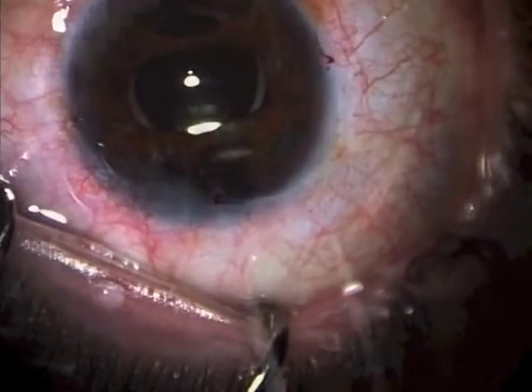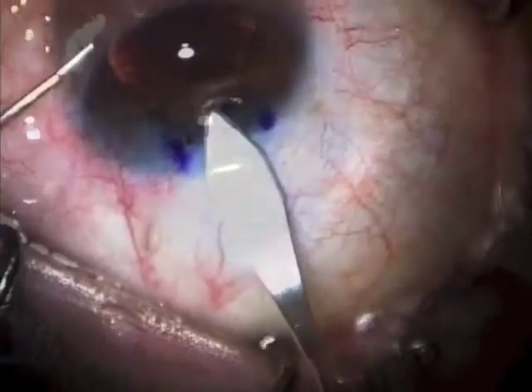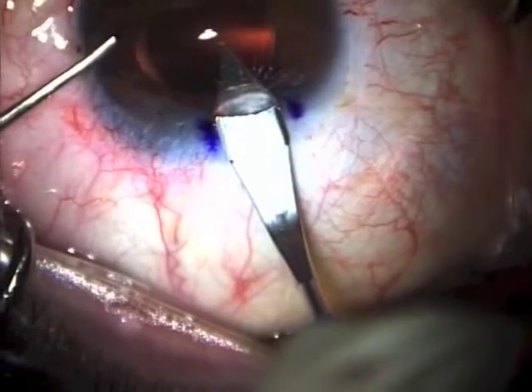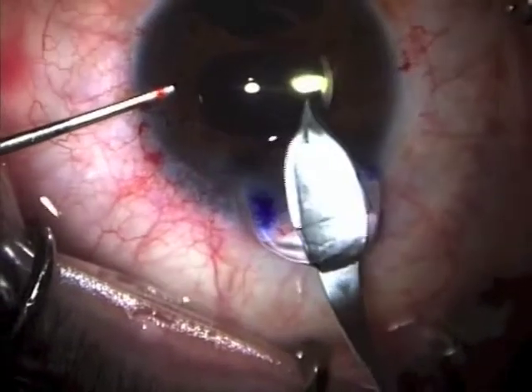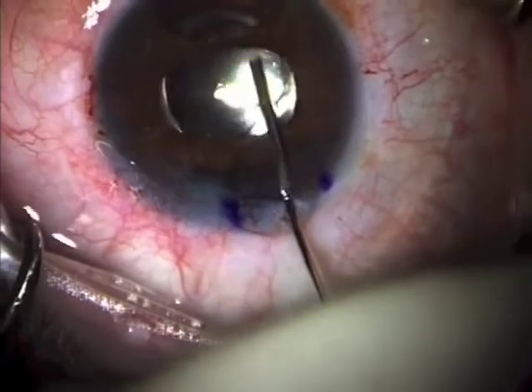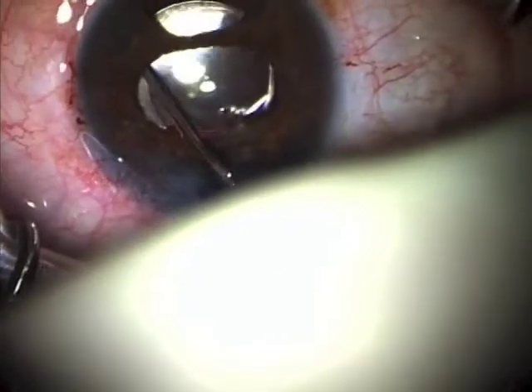We performed a 4.5 mm clear cornea temporal superior incision. We injected cohesive viscoelastic under the iris to create the space to implant the ring.